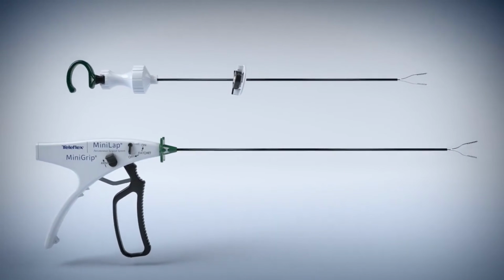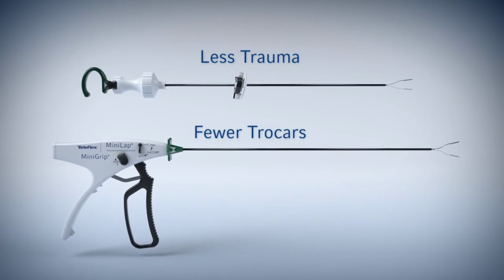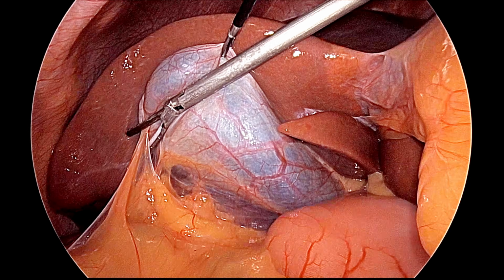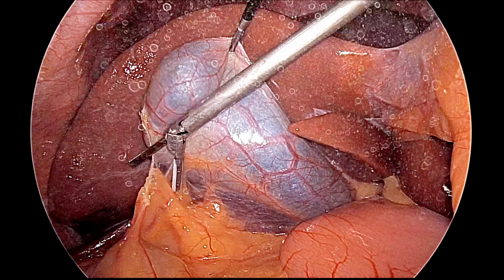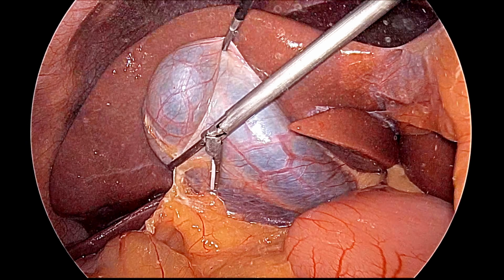So, these are the mini lap instruments which you can use for the third port. It causes very little trauma and it can hold atraumatically any structure which you want. So, the first step is adhesiolysis, and we will remove all the adhesions.